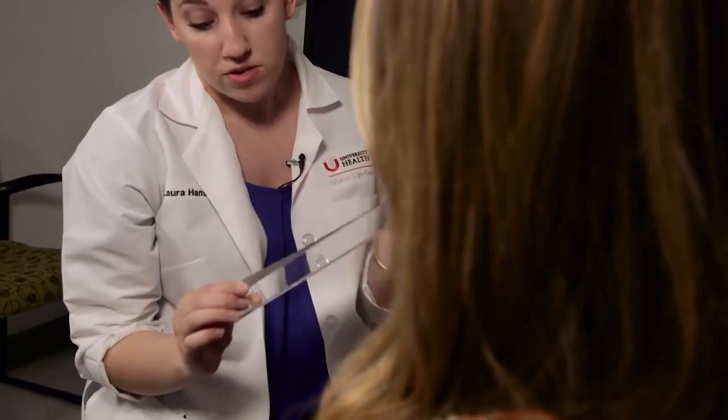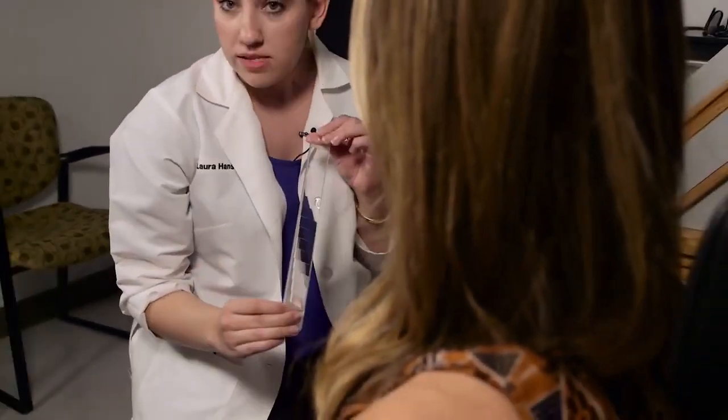This is a prism bar. This is one of the tools that we use in neuro-ophthalmology to measure deviations. Kind of makes it fast and quick. This is a horizontal prism bar.